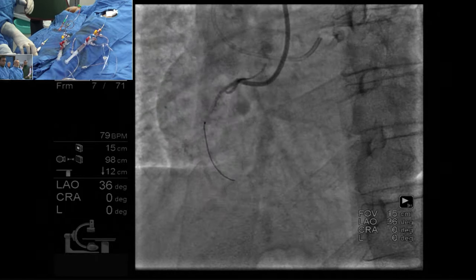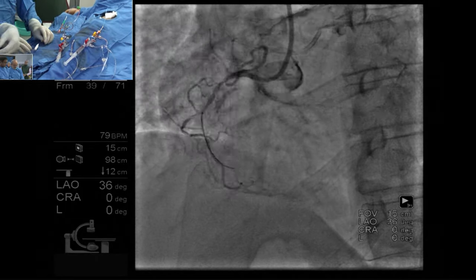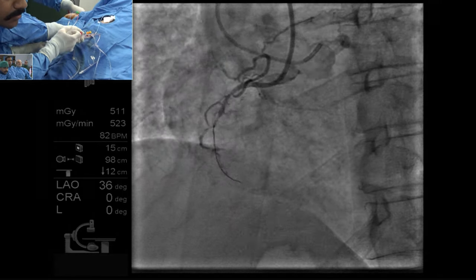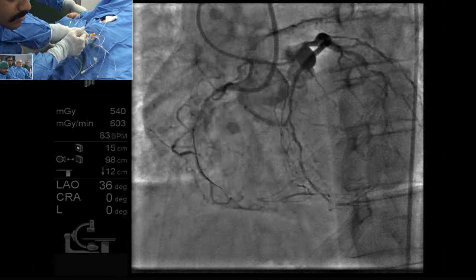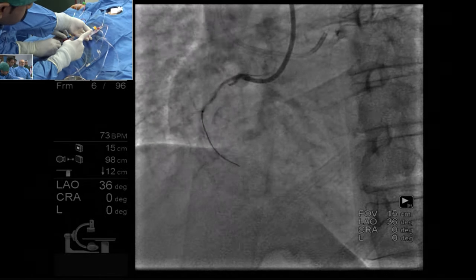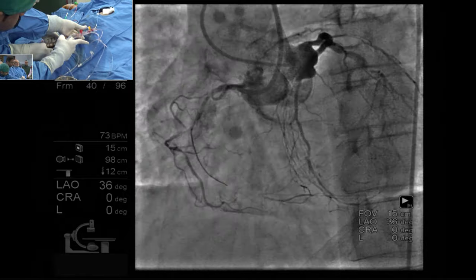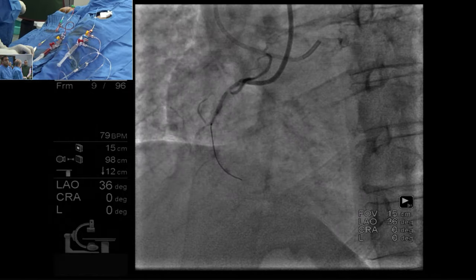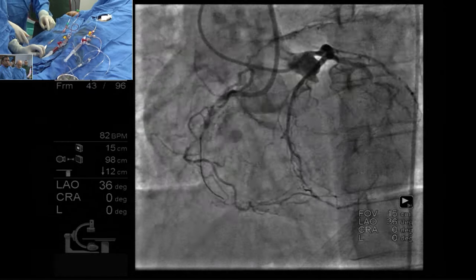Can we have a simultaneous injection from both? That's what we will do. Just take a left injection. We want femoral injection simultaneous. Ready. I am okay till now, I think. Yes, but still another 15 or 18 millimeter to go. Yes, and it is tough.